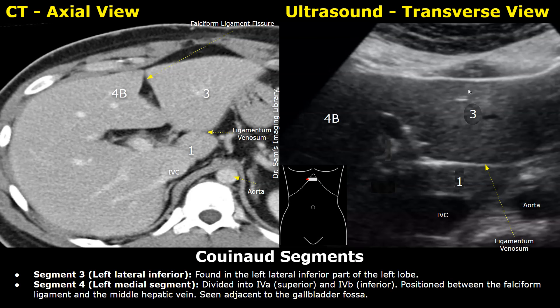This image is obtained by angling the probe towards the patient's head in transverse orientation. This is why we see a part of segment 2 posterior to segment 3. The left portal vein is also visible. This thin hyperechoic line is the ligamentum venosum. Segment 1 is between the IVC and ligamentum venosum, and a part of segment 4 is also visible.